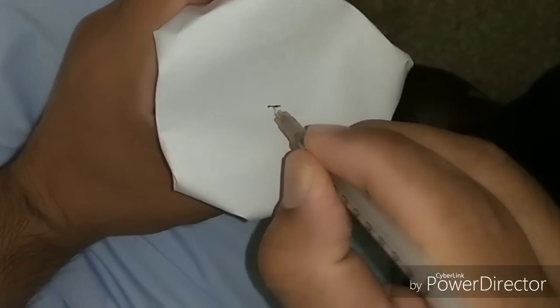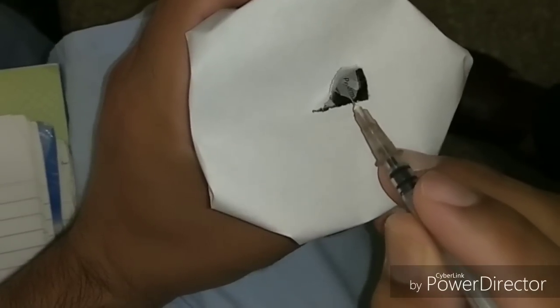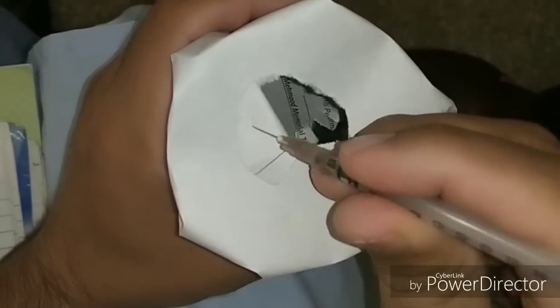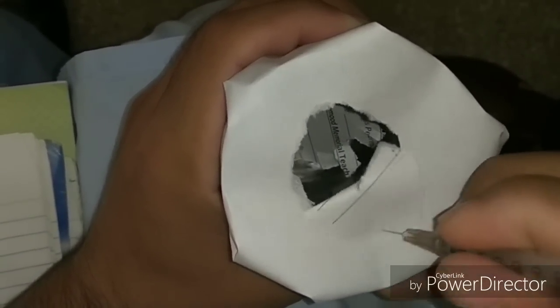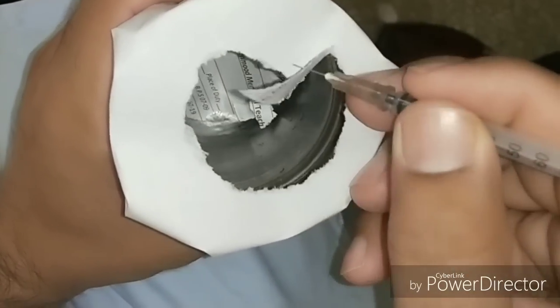For capsulorhexis, place the piece of paper on the glass again with a 1cc needle. Start from the center of the anterior capsule, make a straight line, then put the cystotome beneath it and give a forward force to elevate the flap — that is the most important step. Then move the flap in either direction; if it elevates, come out, put viscoelastic on, make the flap lie on the anterior capsule.